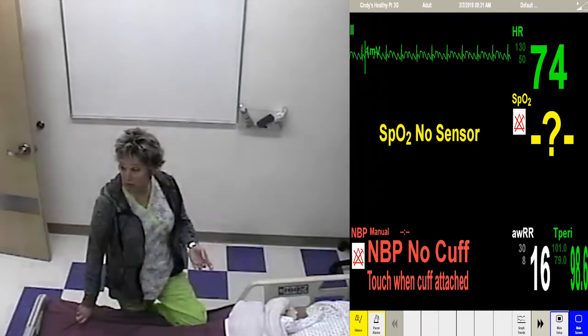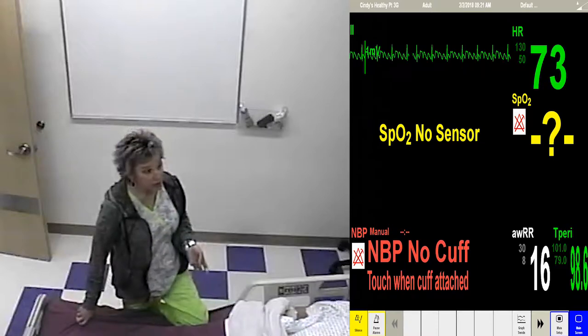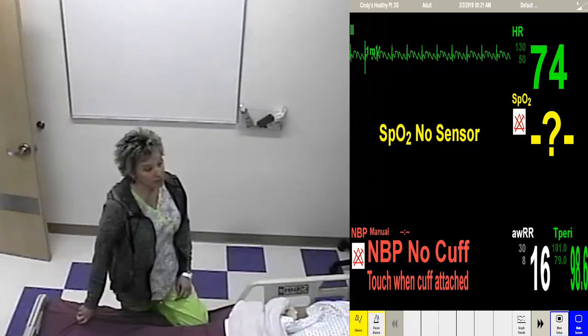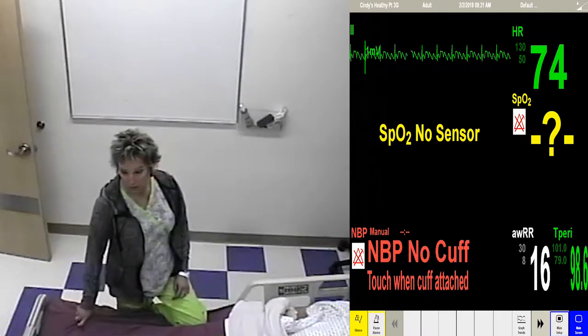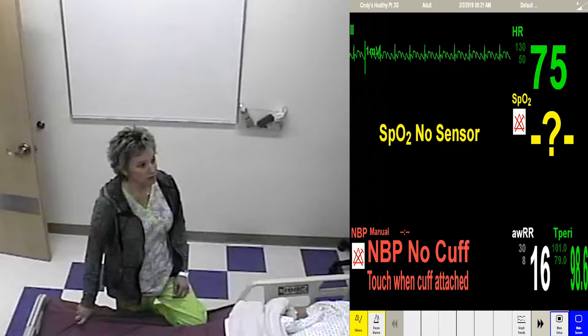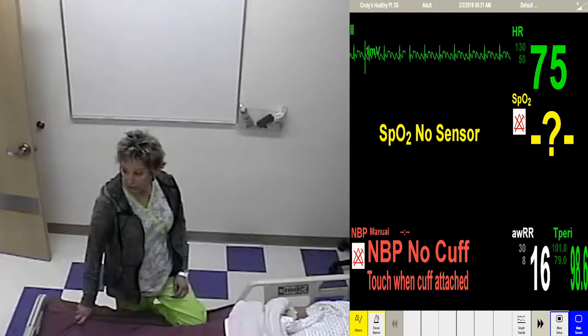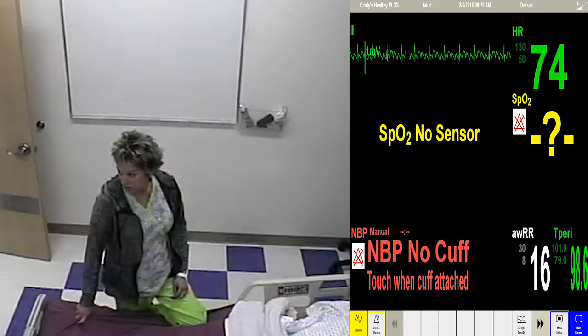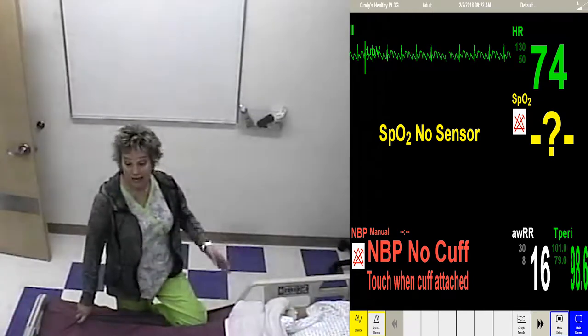So as a review, are there P waves? Yes. Are there QRSs? Yes. Are there T waves? I don't know. Is there a P wave in front of every QRS? Yes. Is there a T wave after every QRS? I don't know, I'm not sure. Bob your head. Is it regular? Yes. Did you answer yes to all of the questions? No. So can this be sinus?